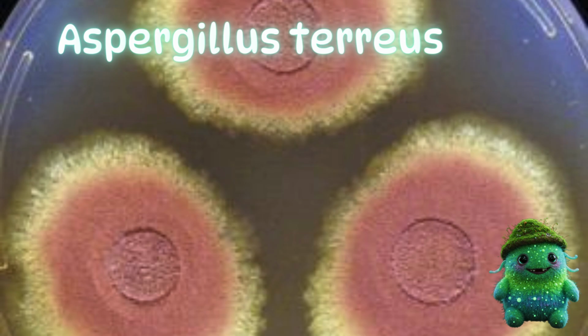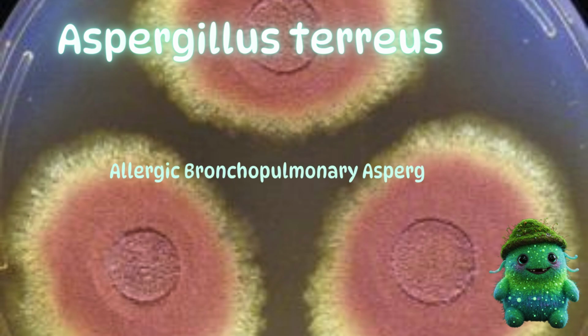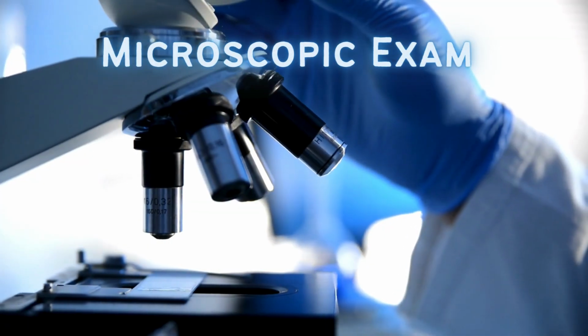Before we move beyond this dominant genus of hyaline molds, we need to talk about Aspergillus terreus, which comes in at number 4 and the last of the big 4 Aspergillus species. Terreus is an agent of allergic bronchopulmonary aspergillosis, and it may also disseminate to other areas of the body. Its colony is a delicious cinnamon brown color, but may be yellowish or sand-colored.